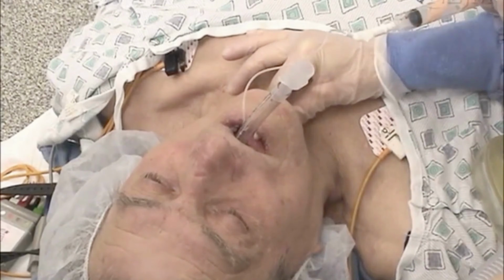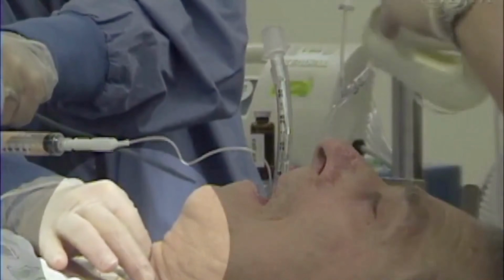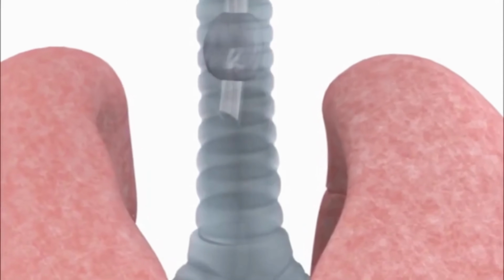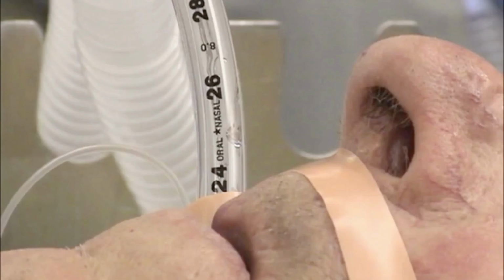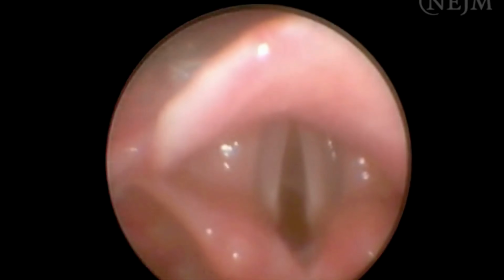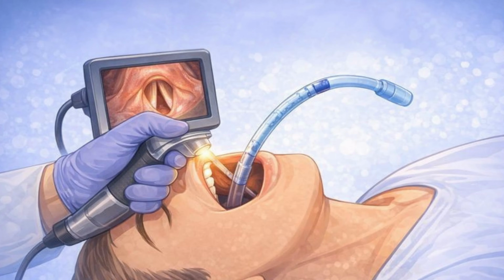Direct laryngoscopy matters because it teaches true airway anatomy. If you can't intubate with direct laryngoscopy, you don't fully understand the airway. And when blood, secretions, or equipment failure take away your screen, this is the technique that still works. But direct laryngoscopy depends on one critical assumption: that you can see the vocal cords. So what happens when you can't?